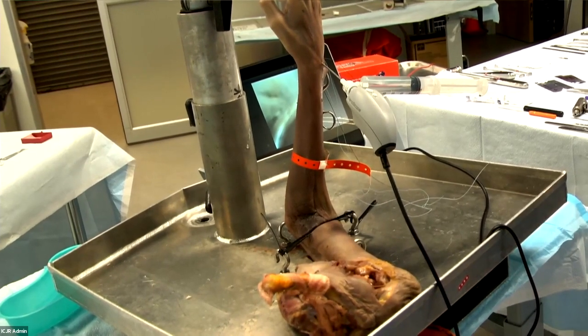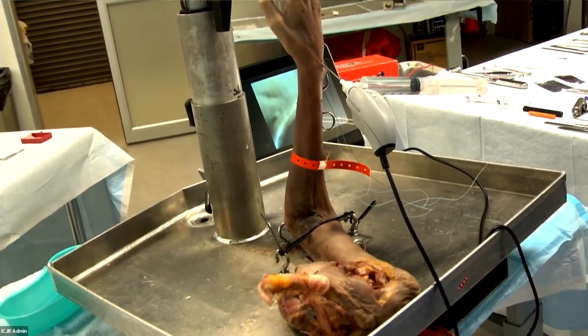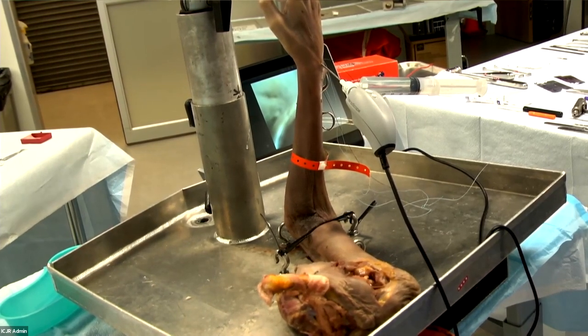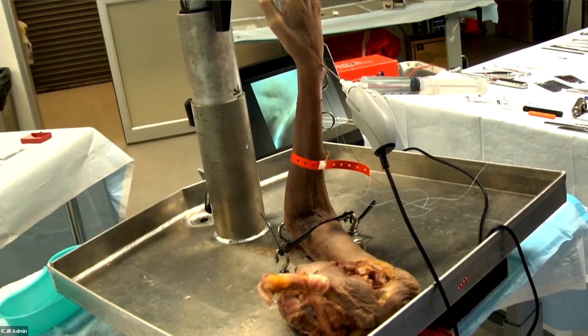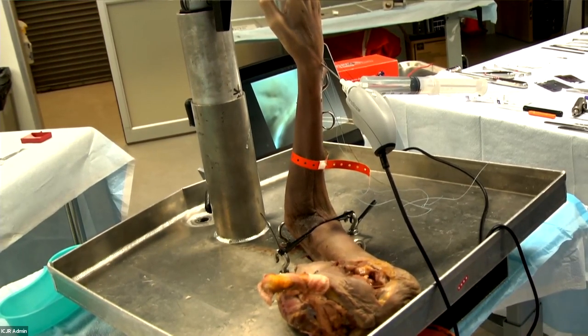The Arthrex nanoscope is a 2.0 millimeter disposable arthroscopic camera. It looks directly ahead. Most scopes we use have a 30-degree or 70-degree angle so you can look around the corner. The nanoscope is super small, easy to maneuver, and slightly flexible. They do have a cannula you can put it through that gives about a 15-degree angle.